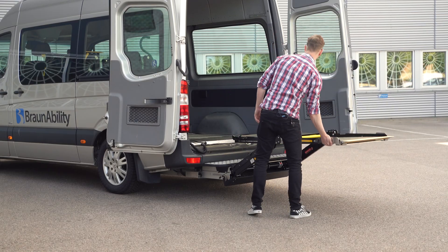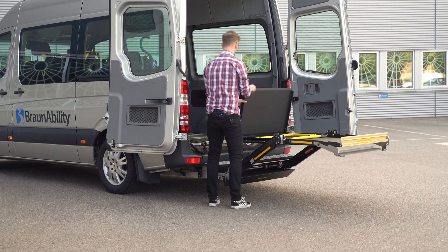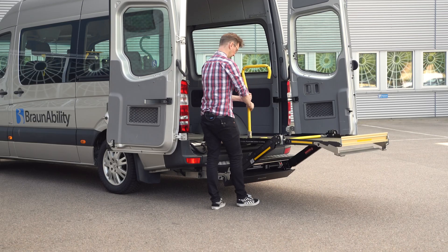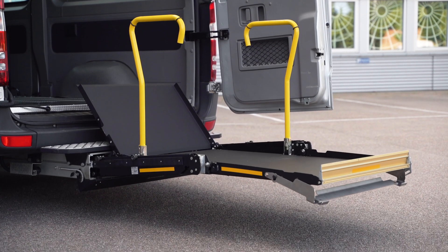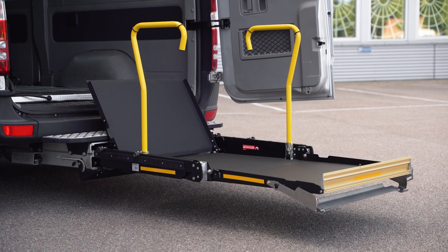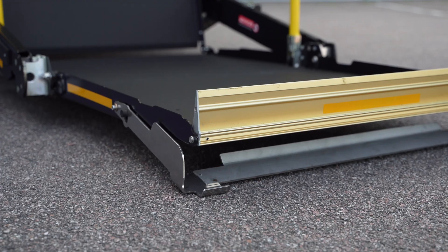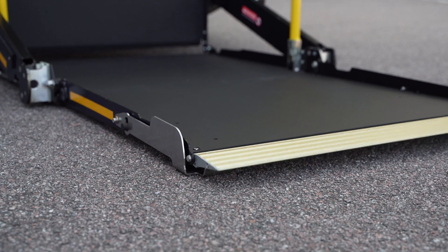For us, a reliable lift should be able to do its job, regardless if it's used several times a day or just once a year. It should be able to withstand the wear and tear that comes from public transport — dirt, water, heat, cold, as well as the passage of time.